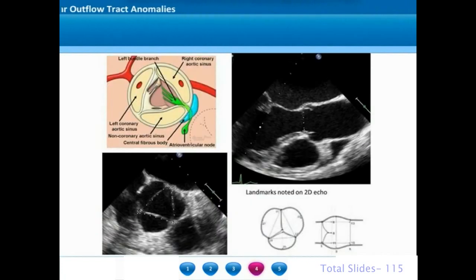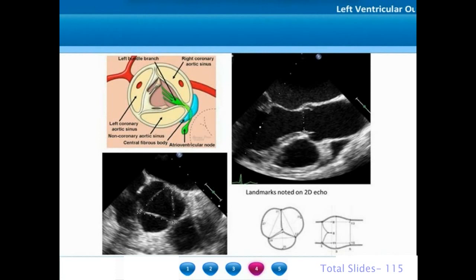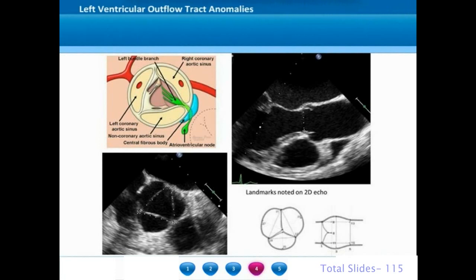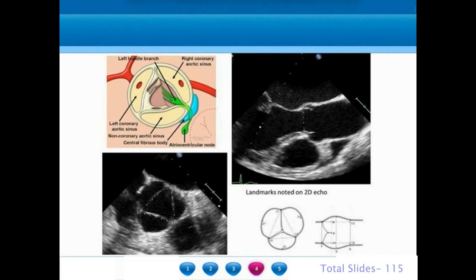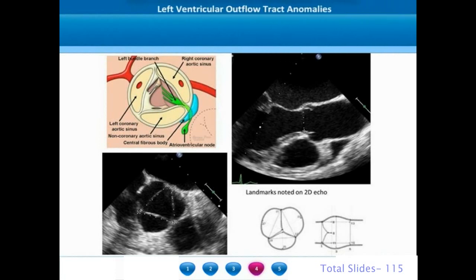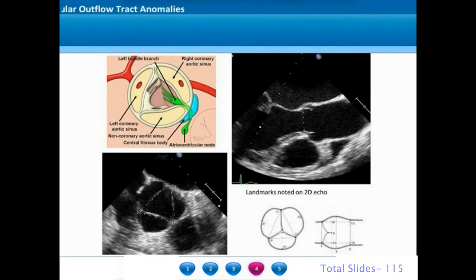On short axis what we visualize is the three cusps of the aortic valve namely the right coronary, left coronary and non-coronary cusps. The right and left coronary cusps give off the right and left coronary arteries. The central fibrous body or right fibrous trigone corresponds to the region of the non-coronary right coronary commissure. This is the location of most perimembranous ventricular septal defects and where the AV node penetrates to form the penetrating AV nodal bundle. The aortic annulus is measured in the long axis view from hinge point to hinge point of the leaflet attachment.